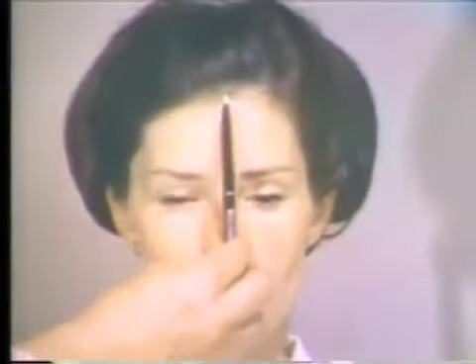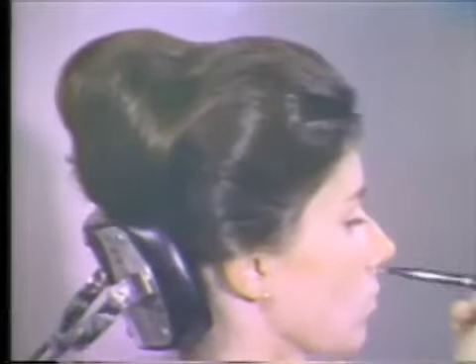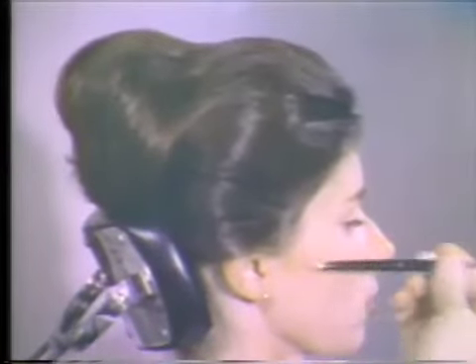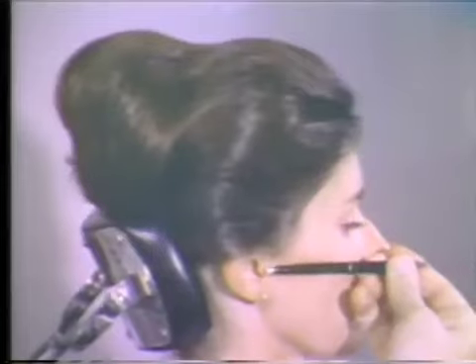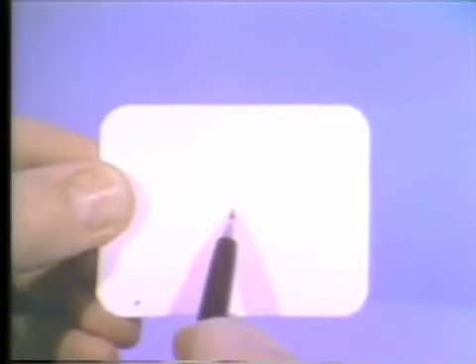The correct positioning of the patient is again important. The mid-sagittal plane must be vertical. In a profile view, an imaginary line from the ala of the nose to the tragus of the ear must be horizontal. To assist our placement of the film packet, we have marked the embossed dot found near one corner of the film, and also placed a dot in the exact center of the film.